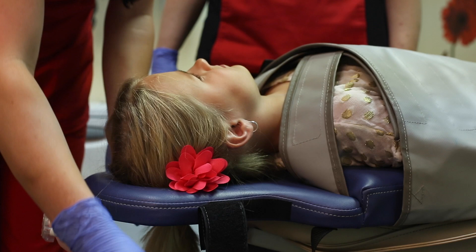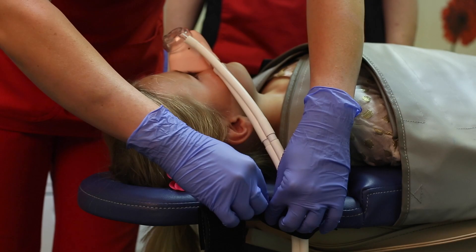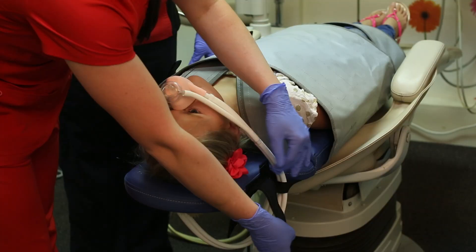If using nitrous oxide, the nitrous hose loops may be used to secure the nasal hood in the optimal position.